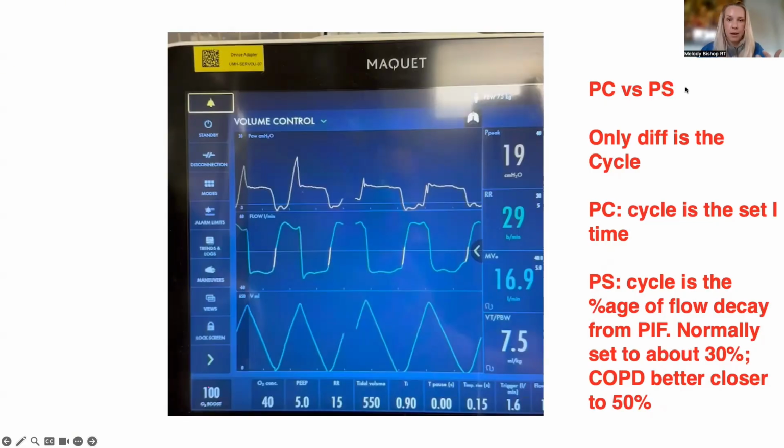So then you, as a clinician at the bedside, are going to be seeing varying dysynchronies that are presenting themselves in very strange ways, because the patient is actively chasing a moving target and you are now actively chasing a moving target. So then you try to adjust your flow sensitivity and your pressure support breaths. But then that's going to change the support that the patient gets, and then they're going to change their work again, maybe in the control breaths. So then you change your inspiratory time, and it's just this vicious cycle that you have put yourself in.